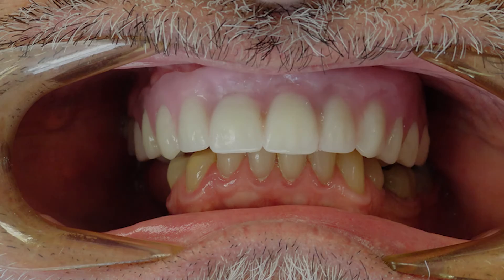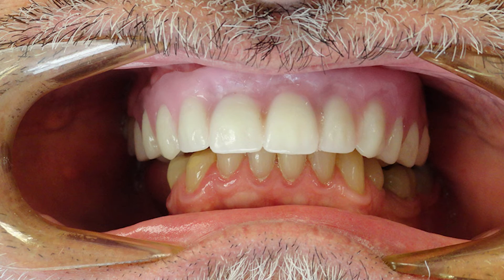Make any adjustments as you would with your standard denture try-in technique. If centric relation is incorrect, a new bite registration should be taken. If a reset is necessary, mark all necessary adjustments. It is extremely important that the patient approves of the color, shape, and arrangement of teeth. The approved wax try-in will be scanned and used in the computer-aided process when fabricating the provisional PMMA appliance as well as the final prosthesis.